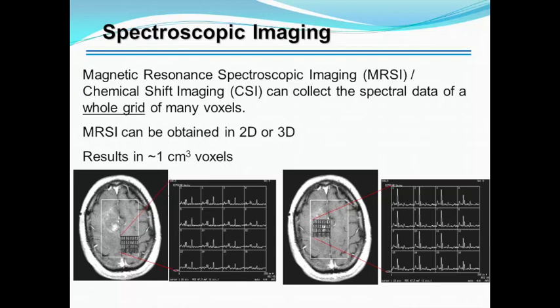You would do this certainly for tumors, right? So this is a glioblastoma, and you get the spectrum of the tumor, then you also see how far it actually infiltrates, and then you get the contralateral side also for free, all in one shot.